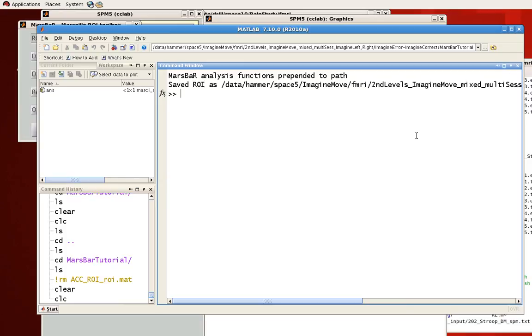So now that we've covered how to create ROIs from coordinates, in the next tutorial we'll talk about how to use MarsBar to create regions of interest from contrasts you've done from other analyses.